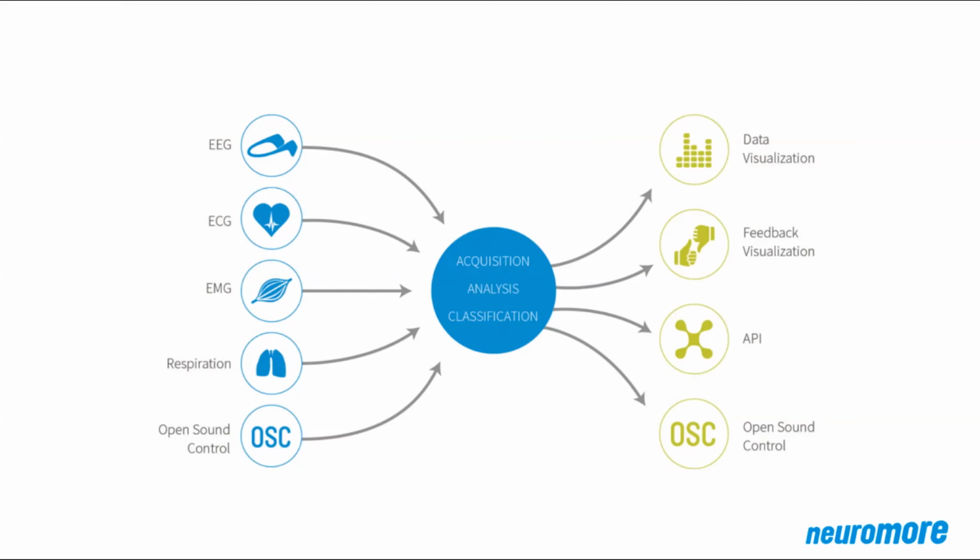So on the one hand, if you want to integrate your own input device or your own output device, you could straight implement it into neuromore studio, and we can talk about it later, which would be that you implement your own node. Or what might be easier for you, if you already have an existing application for input or output, you can just make it talk OSC, and there are OSC libraries for like any programming language out there in the universe.